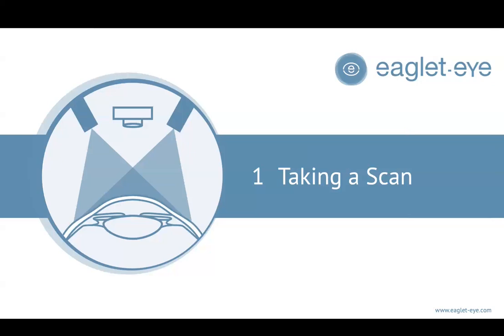When we fit multifocal contact lenses, the number one thing that can cause us to go astray and have a poor quality result is if we go rogue and do things outside of what the manufacturer suggests for fitting a lens. So when we take scans, it's very important that we follow the steps precisely and do the same every single time. In our clinic, we redo this every 6 months now with our staff and train staff on these fitting protocols so that the results are very accurate and also very consistent.